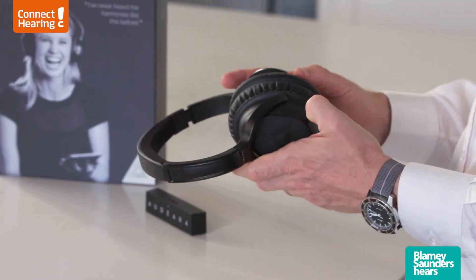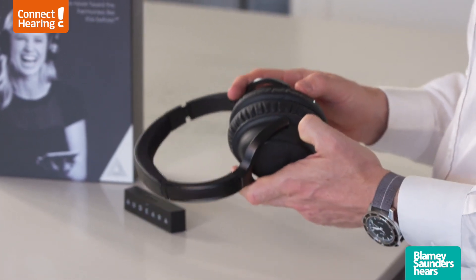To pair these to your phone or your tablet, they pair like any other Bluetooth device. You'd hold down the pairing button on the left hand side of the headphones themselves, connect them, and then you'd be up and running and able to stream your sound through from whatever you're using.